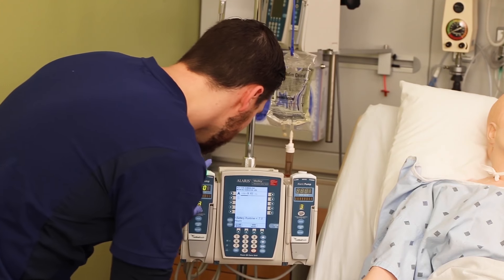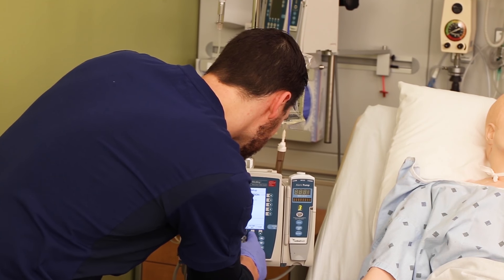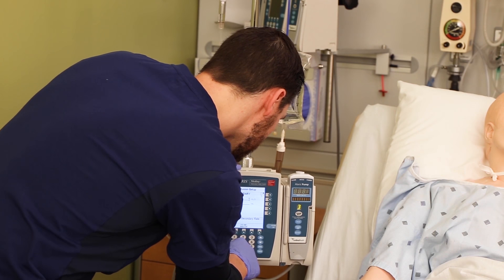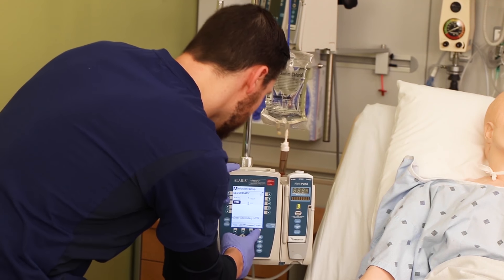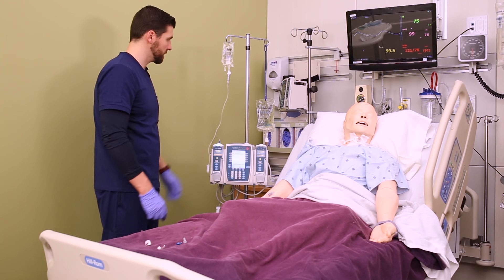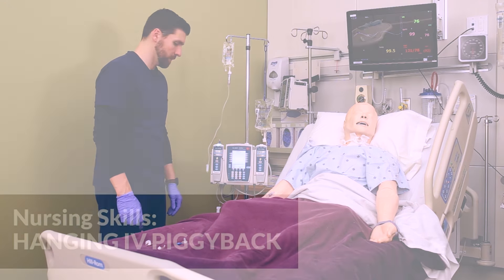Now you can set the pump for a secondary infusion. If you aren't sure how, make sure you check the manufacturer instructions or check with a more experienced nurse. Make sure you're setting it according to the ordered rate on your MAR, and then unclamp the secondary tubing before you hit start.